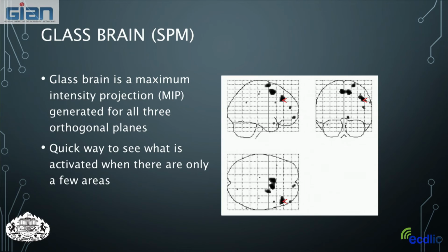And when you look at the axial view, this is where you are. So we're looking at this spot in each of the 3 planes. They each give a unique sense of where this spot is in the brain. So you sort of have to incorporate these 3 views together in your own brain and integrate your sensory information to understand where this spot is.